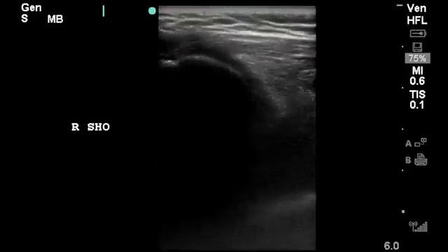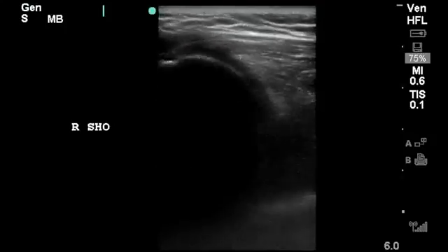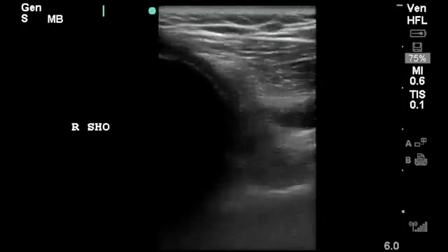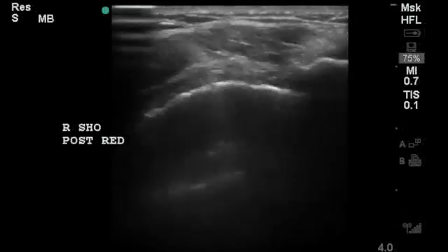If you didn't have the x-rays or the obvious shoulder deformity to work with, you'd now be pretty certain, based on just your ultrasound, that this patient was dislocated posteriorly, and you would then apply the requisite yanking and pulling. After doing so, you would probably see this.